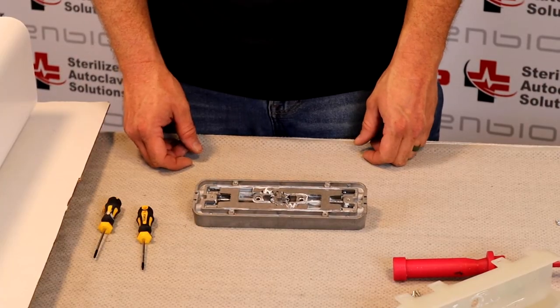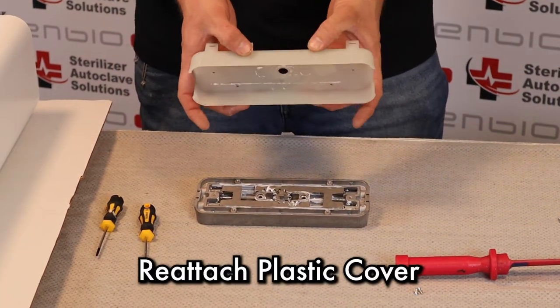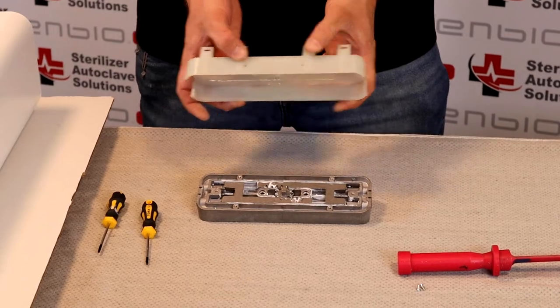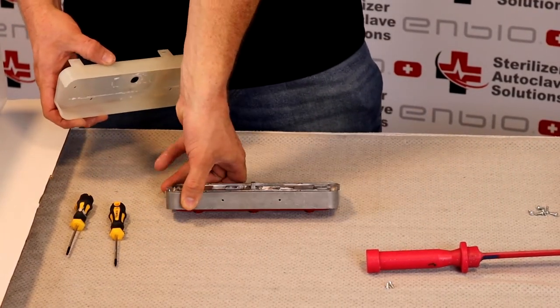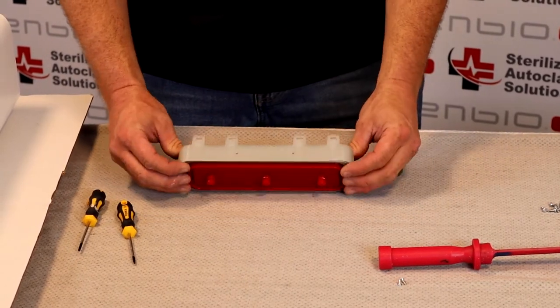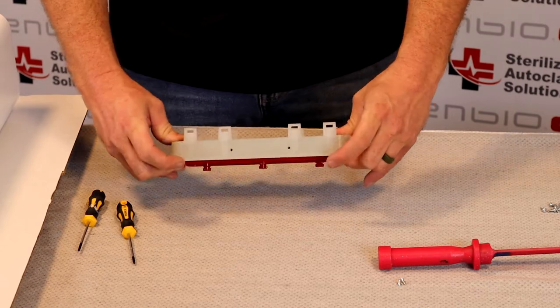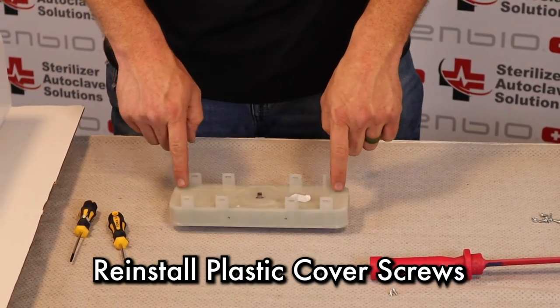After installing those four screws, I'm going to make sure that I am putting the bottom part of the plastic piece with the bottom part of the base. This will just snap into place. Those holes should line up, and I am going to install these six screws.